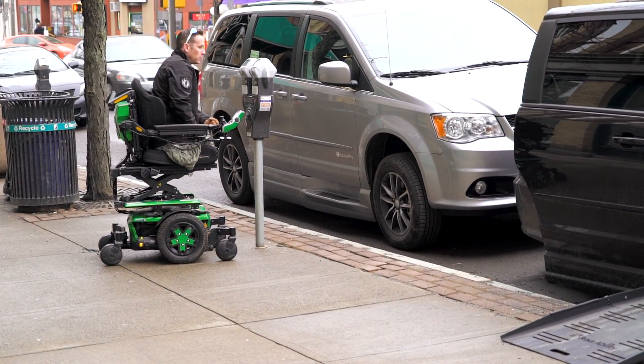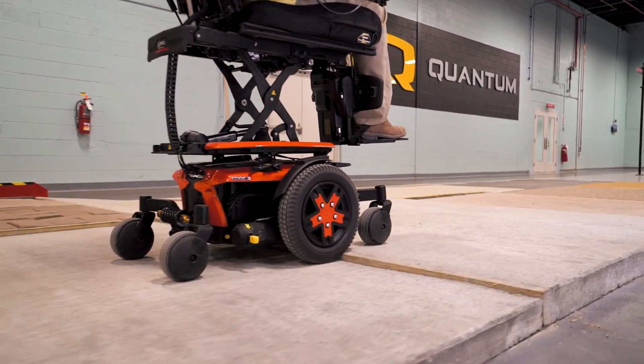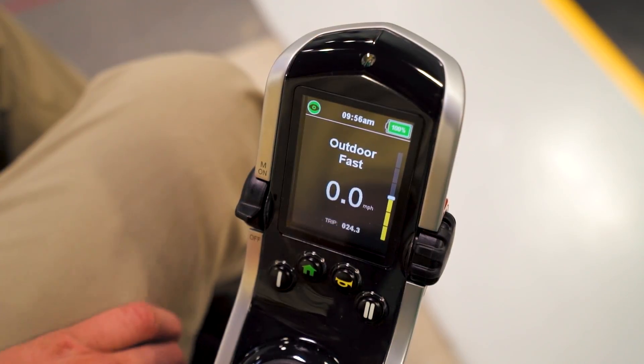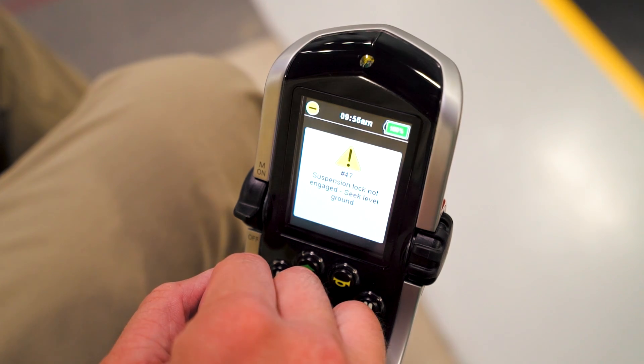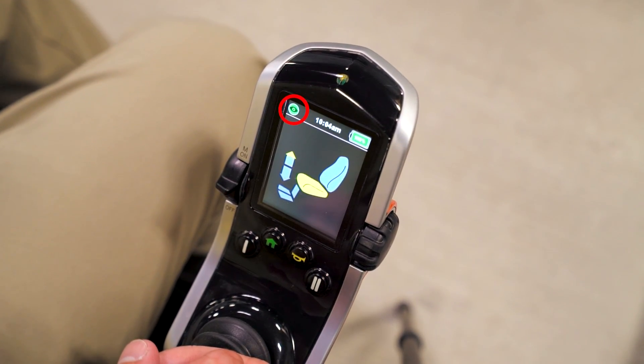Once the lift is activated, iLevel locks out the movement of the front caster wheels while still allowing 1.5 inches of safe climbing mode. If the Quantum Power Base is not on a level surface, the controller's screen will display a message that iLevel is not engaged. When the Quantum Power Base is on a level surface and the iLevel system does engage, an icon appears on the controller.